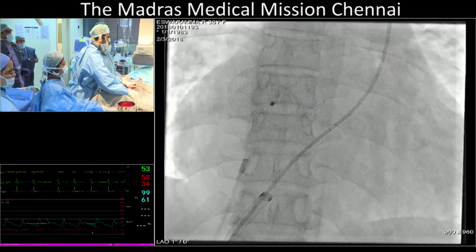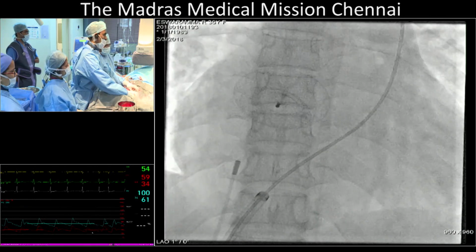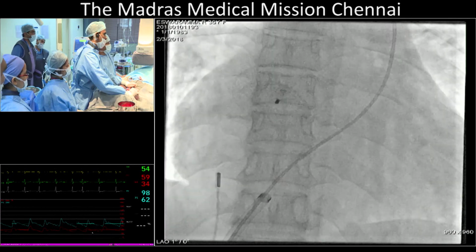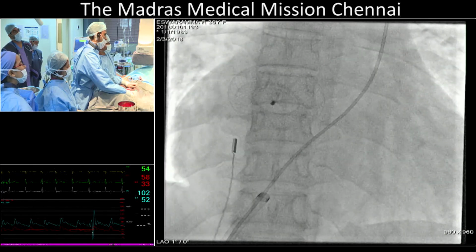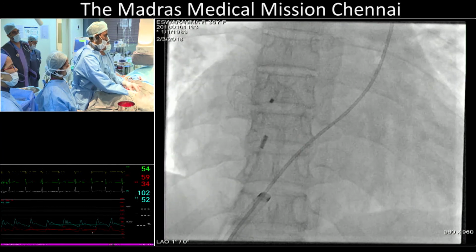Just a simple comment for Shiva regarding when the device takes a cobra shape in the left side. Maybe it is due to undersizing the sheath or keeping the device for a longer time in the sheath. Most of the time we use a balloon and don't succeed to fix it.